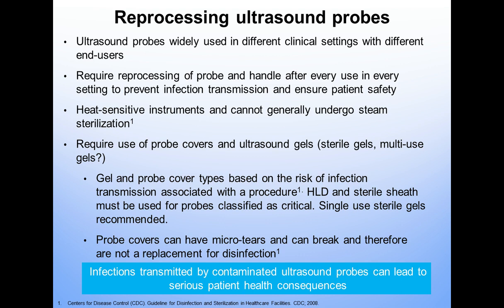So probe covers depend on the risk of transmission of the procedure that you're performing. If you're performing an abdominal ultrasound, then you can use a general probe cover. It doesn't have to be sterile, but certainly if you're performing a procedure or assisting in the perioperative, in the OR, in critical care, some areas, you should be using a sterile probe cover.